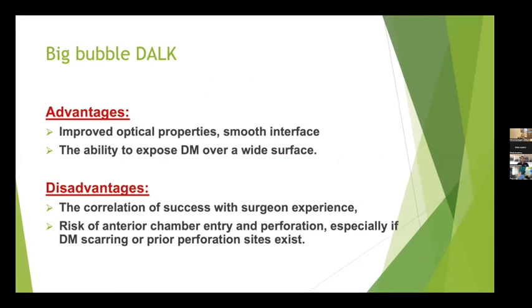So in comparison to the manual dissection DALK and the microkeratome DALK, the big bubble, as Professor Liu has explained, would get us to a smooth dual layer plane. That will improve the optical property of the interface. There's also the ability to expose Descemet's membrane over a wide surface. Unfortunately, that technique doesn't come without disadvantages.